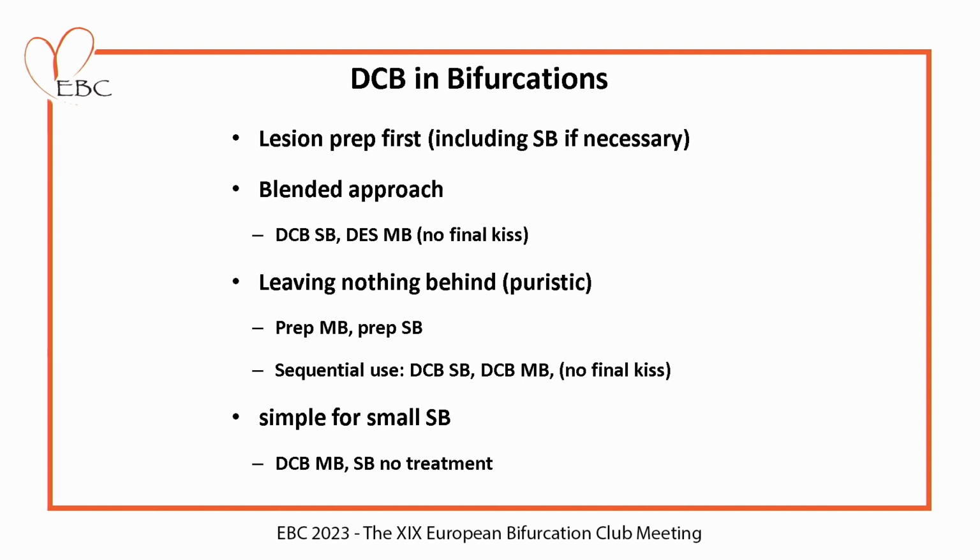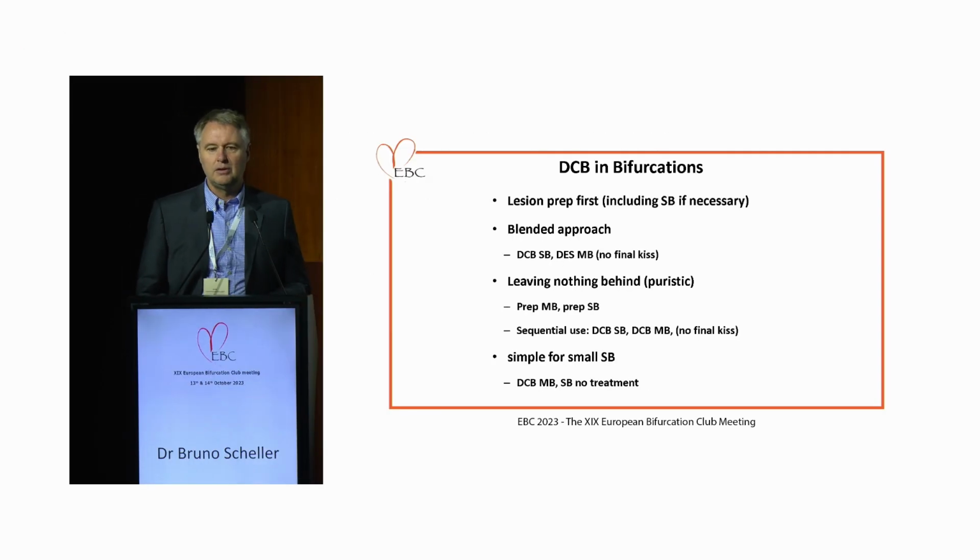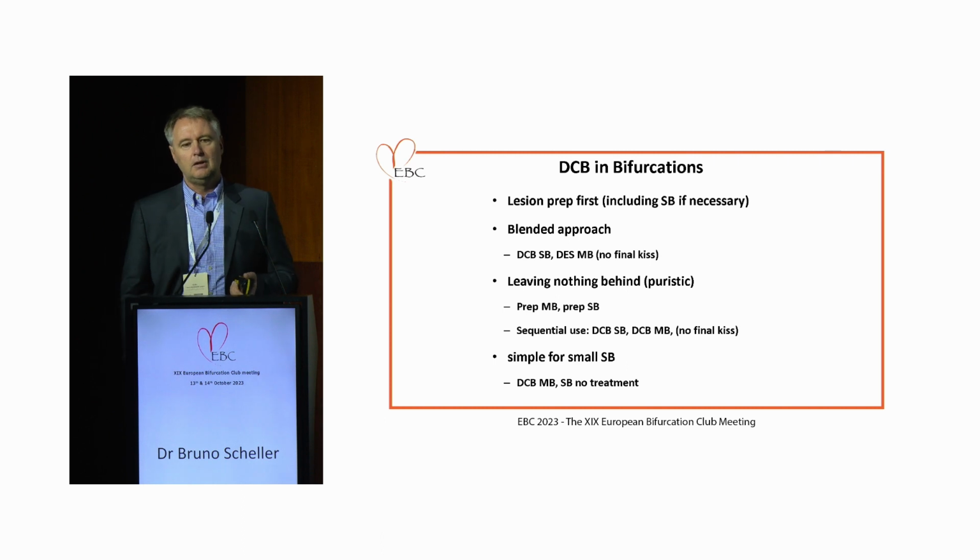So this is already my conclusion. DCB and bifurcations: lesion preparation is the first most important step, and it should include in this strategy the side branch if necessary. We have different scenarios.